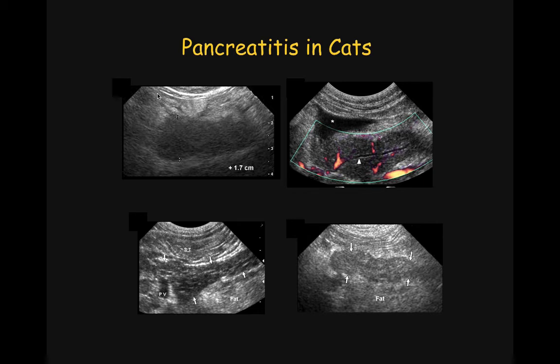On the top left, we see a thickened hypoechoic pancreas surrounded by bright fat, just like what we see in dogs. Similarly, on the top right, we see an enlarged hypoechoic pancreas surrounded by hyperechoic fat. We also have the presence of a small amount of anechoic effusion, and power angio was performed to recognize the difference between flow within the vessel and the lack of flow within this prominent pancreatic duct. A prominent pancreatic duct can be seen in pancreatitis, but it can also be seen in normal cats, especially if they are old.